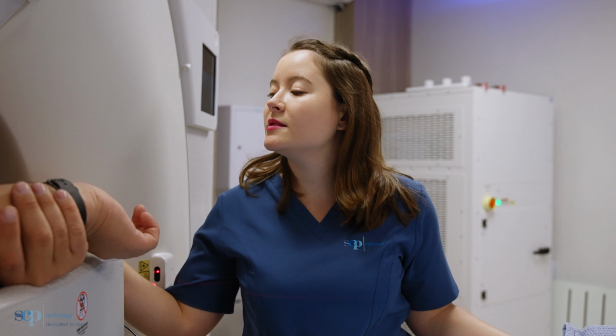It's a 3D image, so we can see the entire heart, all the coronaries in a 3D view. It's a very quick scan. It's not as invasive as if you had to go to theatre. It's half a day at most.